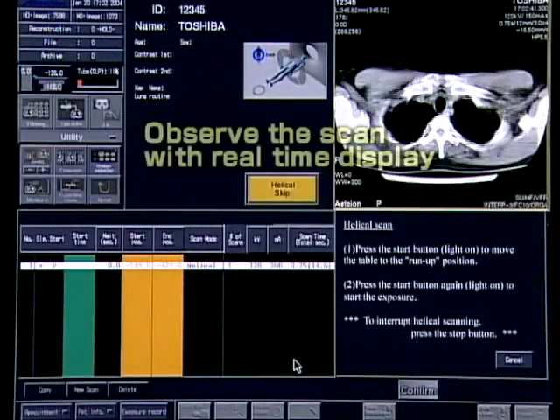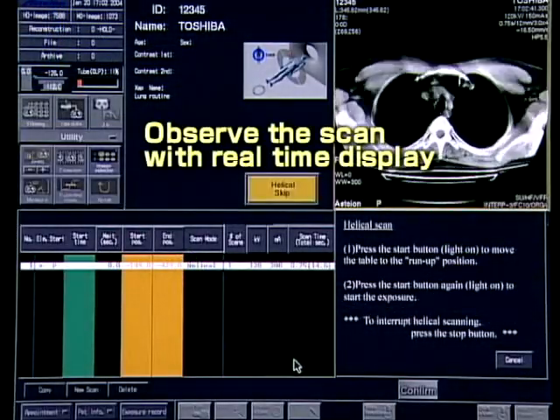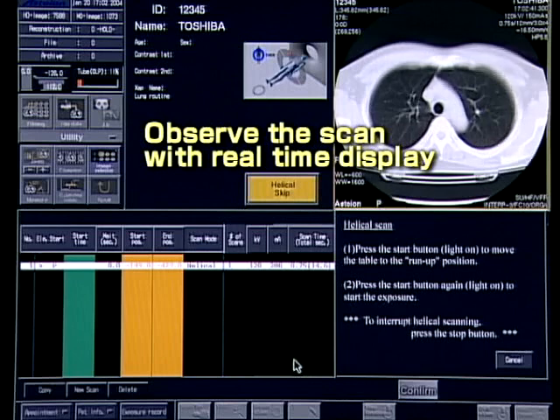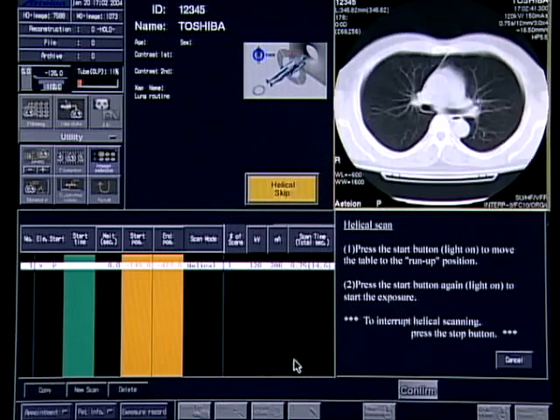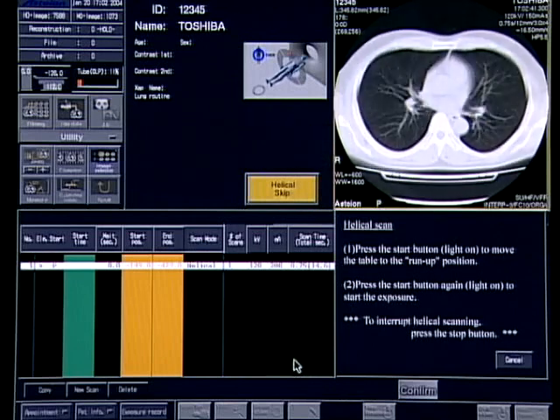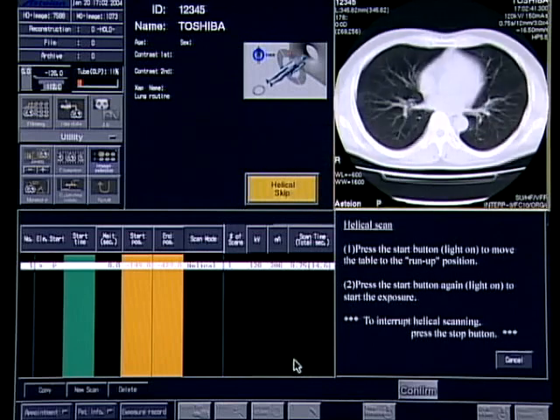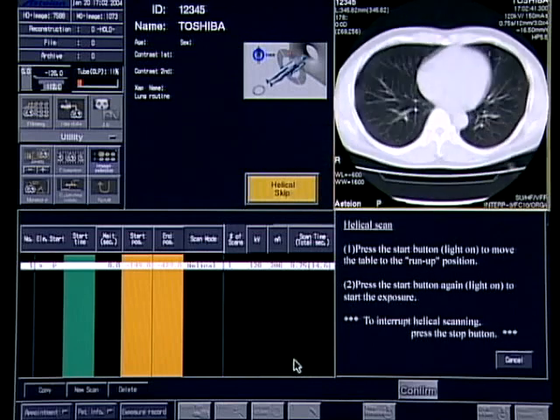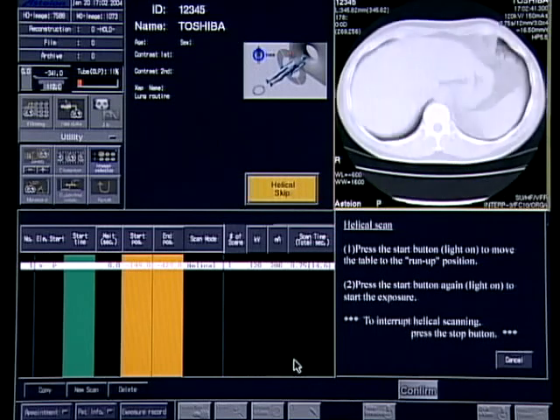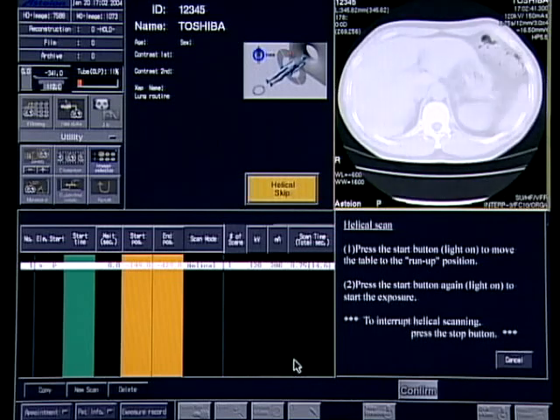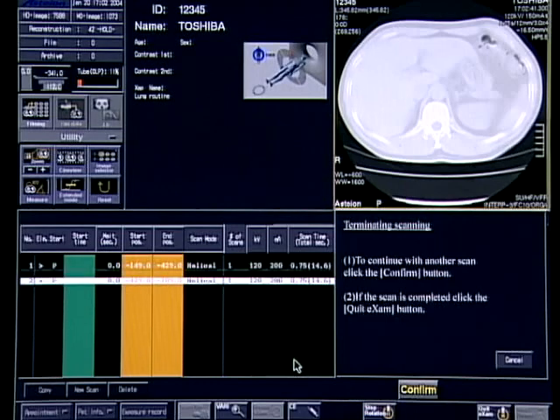In Astian Super 4, images are processed at a speed of 12 frames per second and are displayed in real time during scanning. It can be stopped as soon as the desired range is completed, helping to prevent unnecessary X-ray exposure.